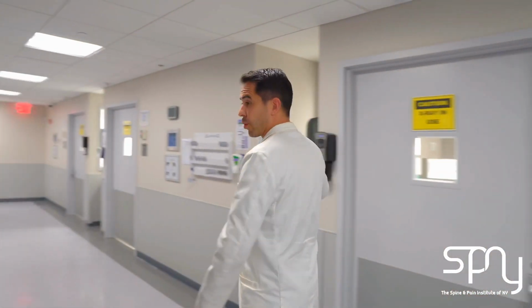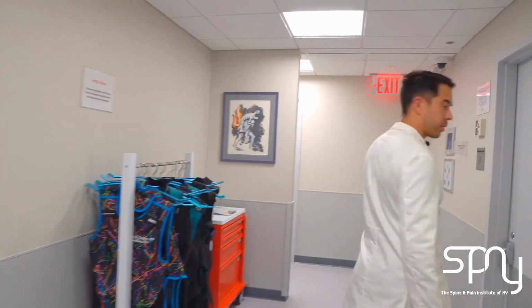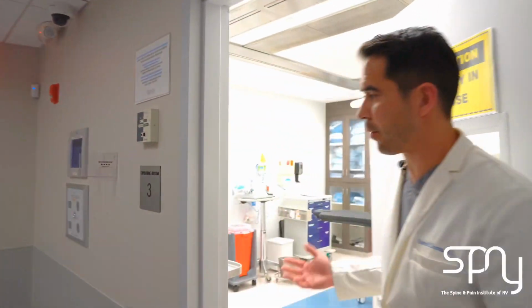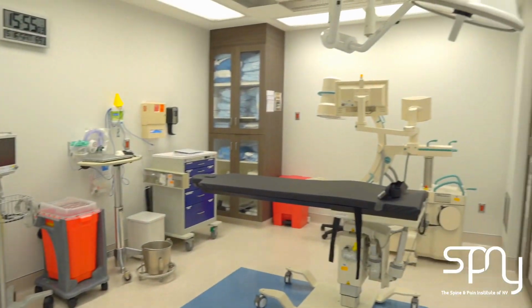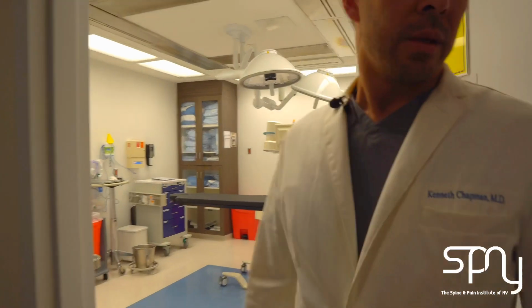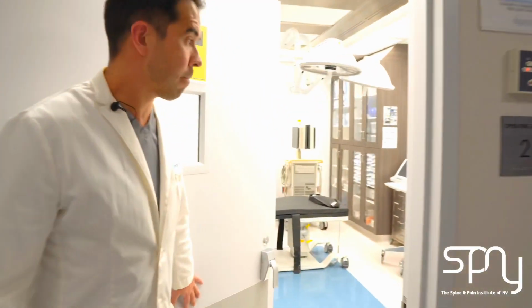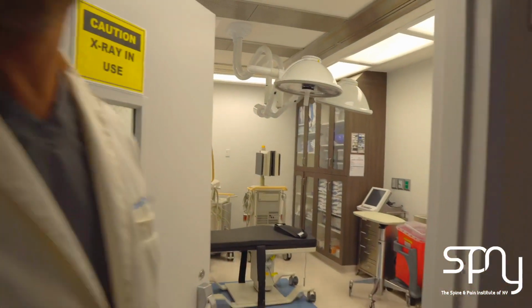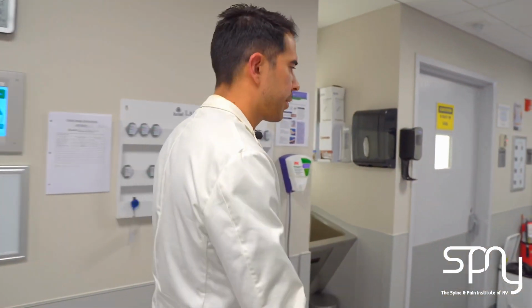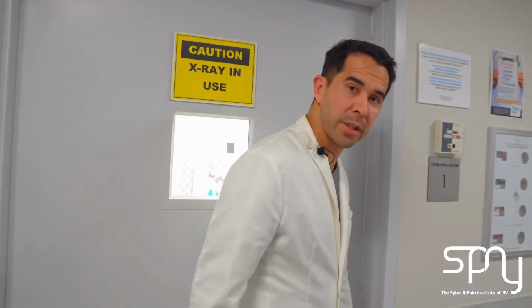Here's our sterile corridor. Our 3 rooms are here on our right. 2 of the rooms are essentially similar, and those are really meant to perform your typical minor procedures, epidurals, blocks, you name it. And here we have essentially an identical room. You can see we have neurotherm ablation machines and Stryker units. So within the practice, I think we have 4 or 5 neurotherms and 2 or 3 Stryker RF units. Not at this facility, but across them.